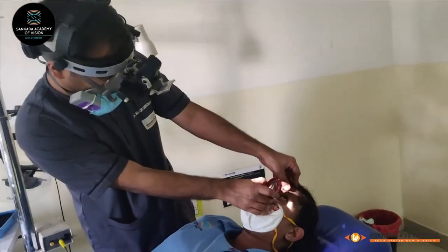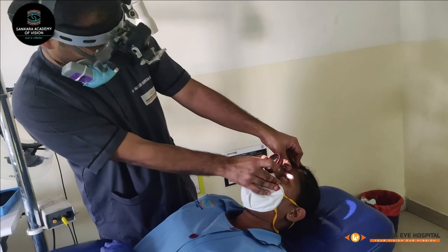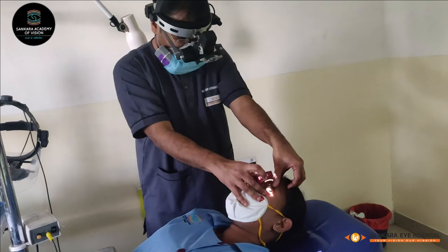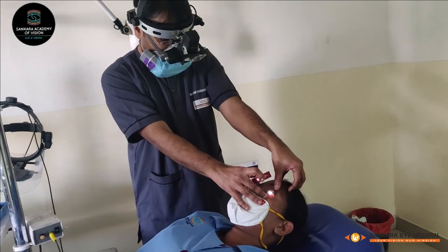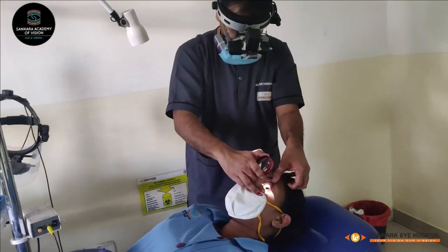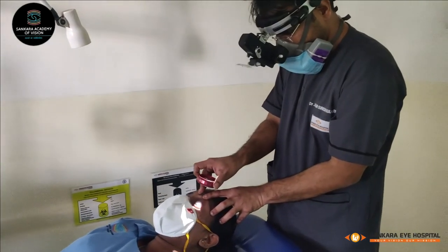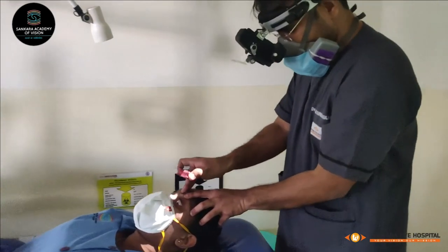Start with the peripheral view, as this will help acclimate the patient to the light. Start by getting the patient to look in the direction of the area of interest and stand opposite the clock hour to be examined. Move around the head of the patient to examine different quadrants in a sequential manner.